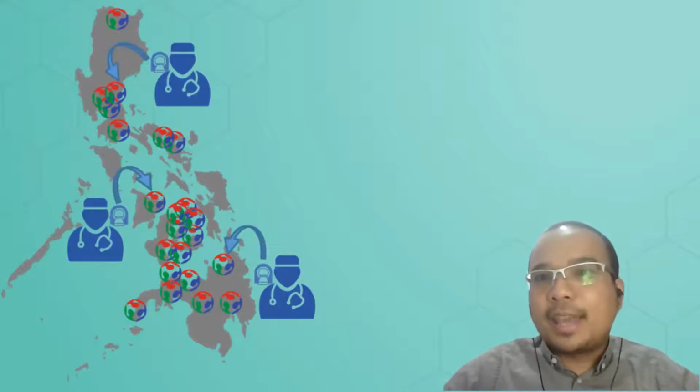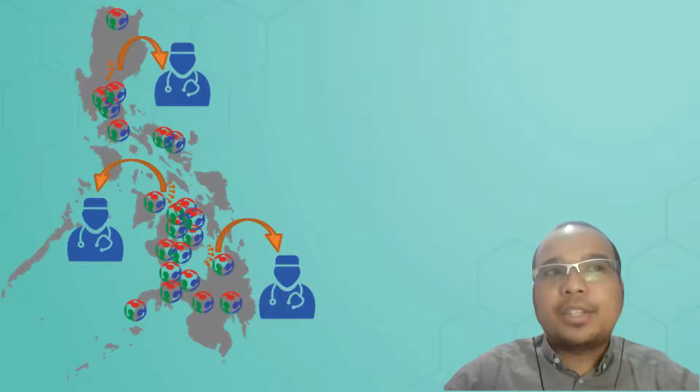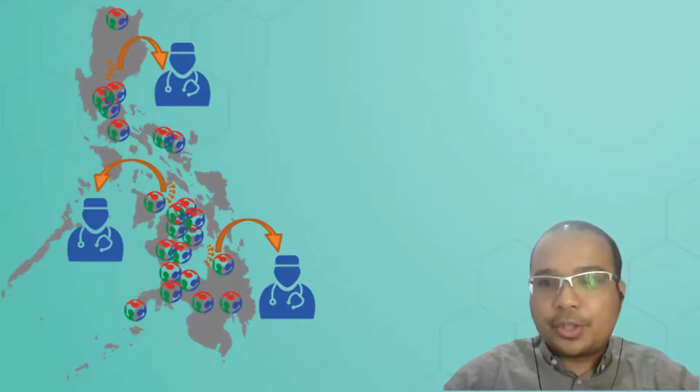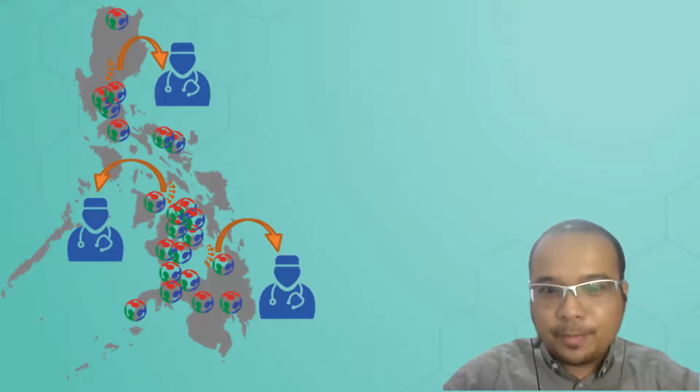You can send them the DICOM file from your MRI or from your CT scan, and then they can give it to you physically, or if not, send it to you via courier, the anatomical model that they have developed using their 3D printers. Now this is a good solution. But what if there's an even better solution?